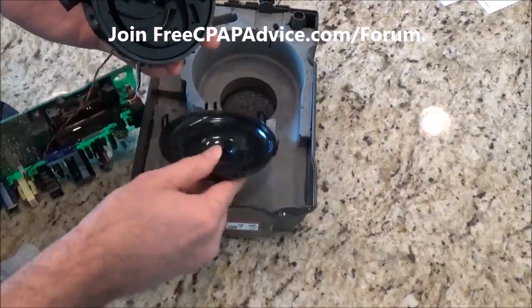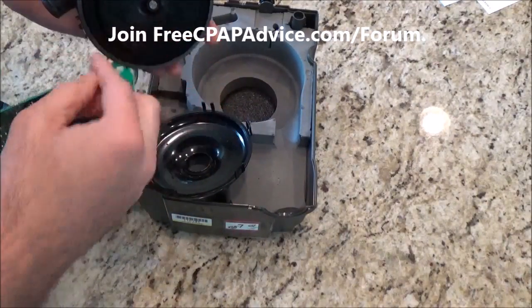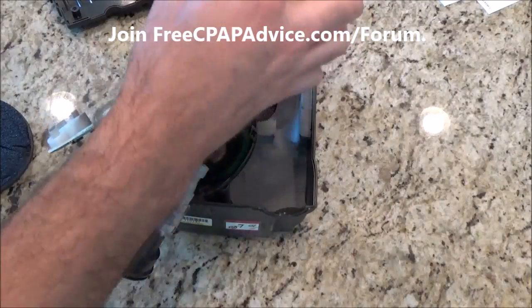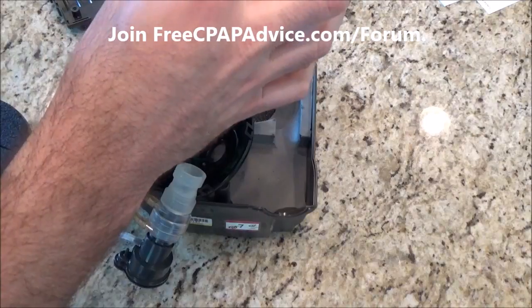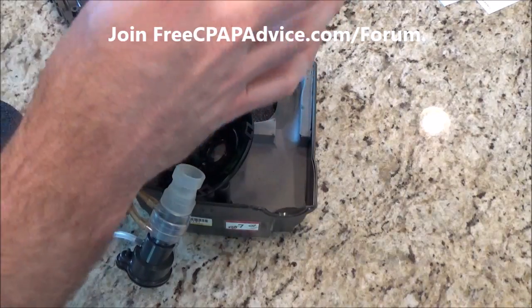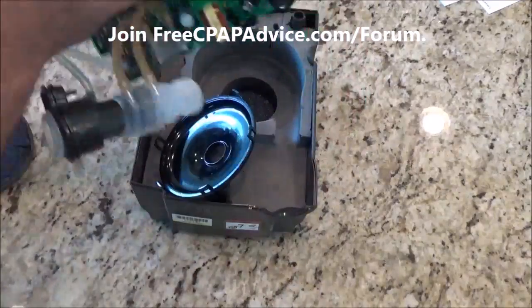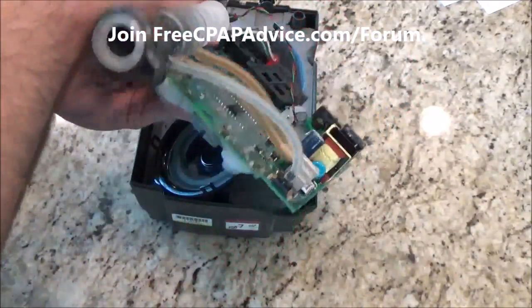And then you have this, which probably gets all the information from what the pneumotac is saying, and then it speeds up or slows down based on what you need. Anyway, this thing spins fast enough that it forces the air, keeps your airway open. That's pretty cool. That is awesome. So I guess all the magic lies on this board. I have no idea how it works.